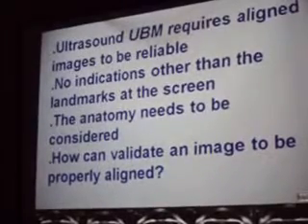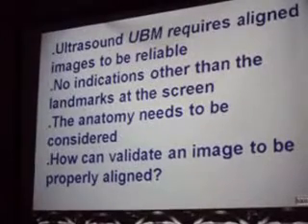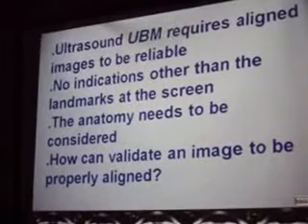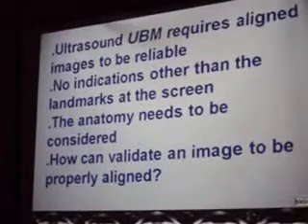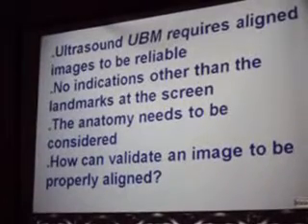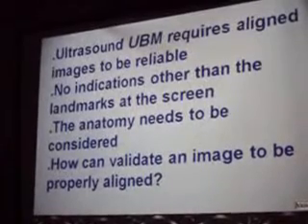Any correction of the position of the probe must be done seeing the picture on the monitor. There is no other external reference that's going to guide you and tell you whether you are right or not. You are forced to look at the picture.